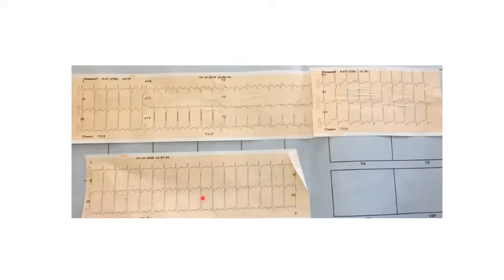But chronic arrhythmia, I think we should think of a possibility of atrial septal defect as the first one. We can definitely discuss the possibility of pulmonary embolism giving rise to all these problems. But usually in a patient with pulmonary embolism, right axis deviation is not very common, because there is no time for the patient to develop right axis deviation.